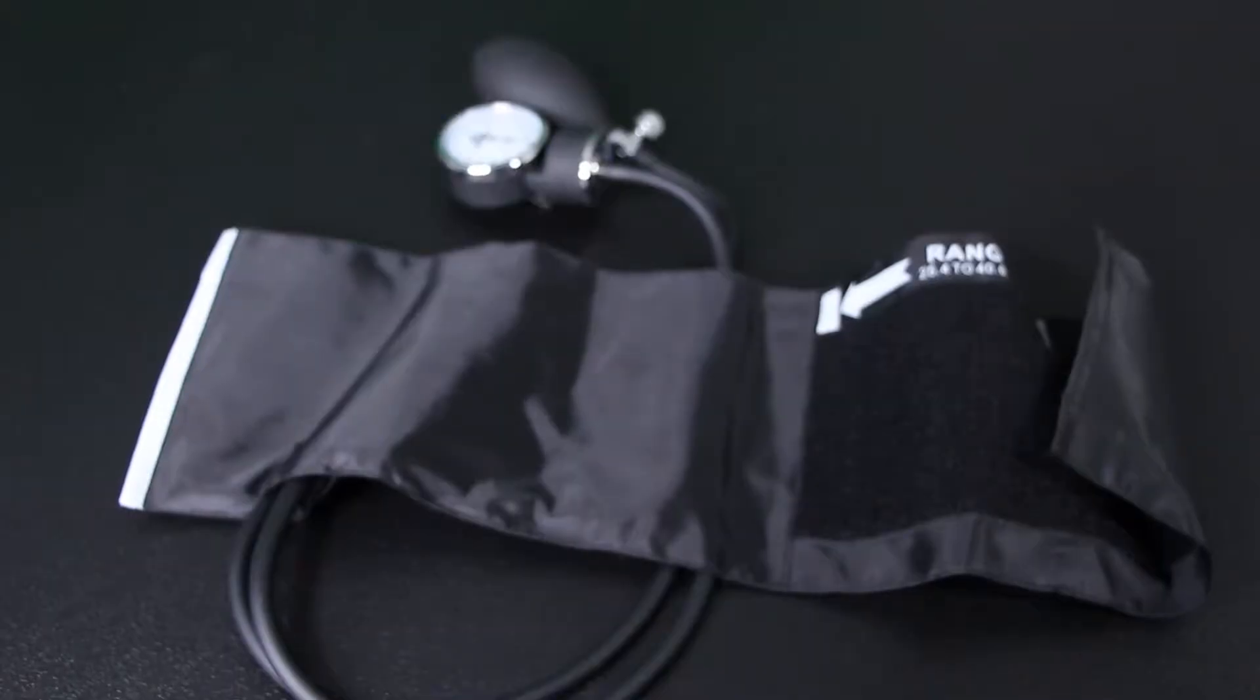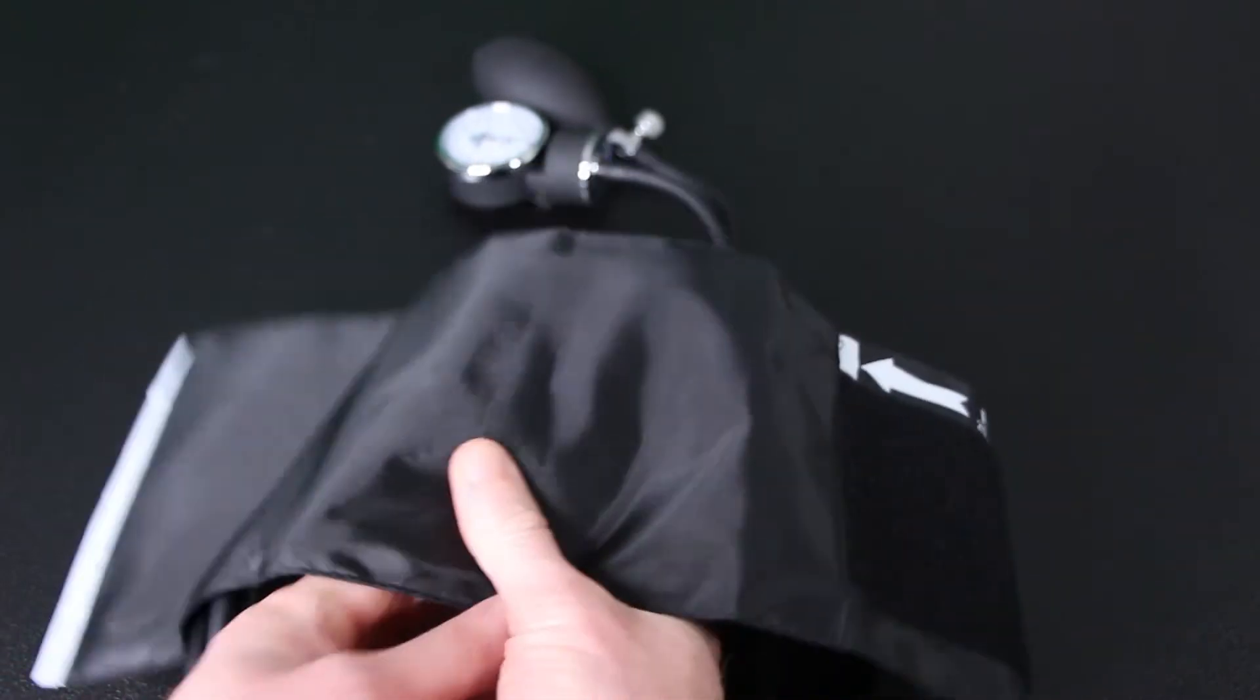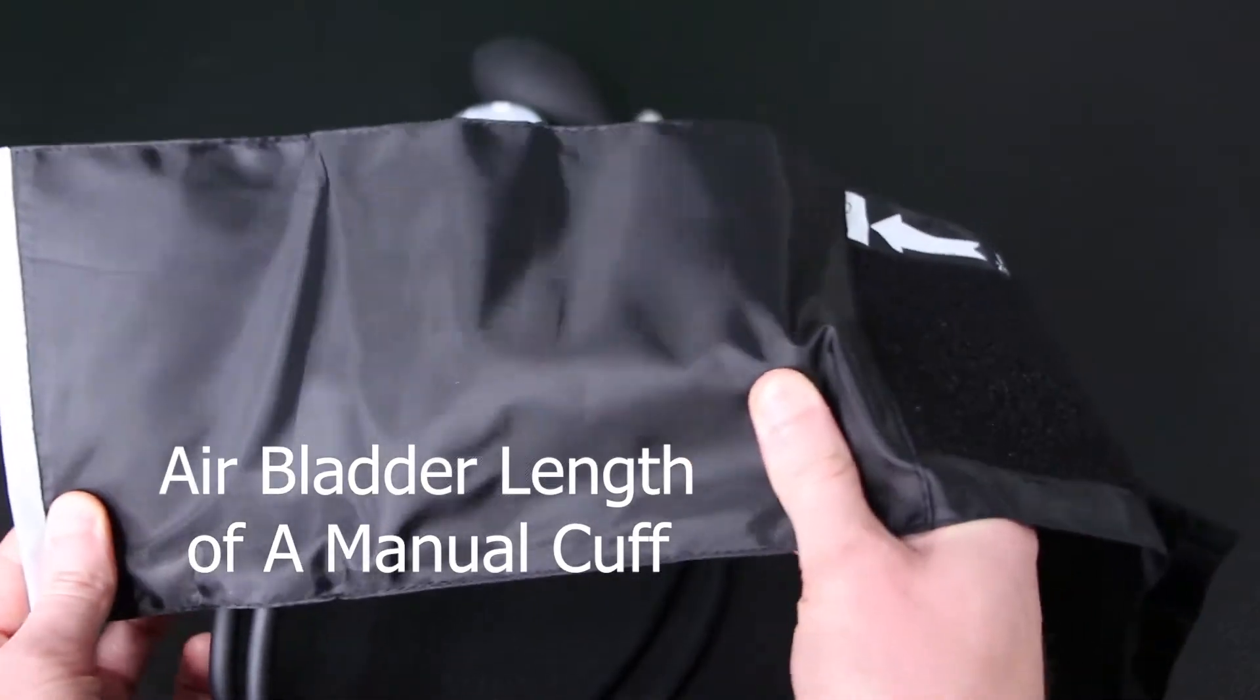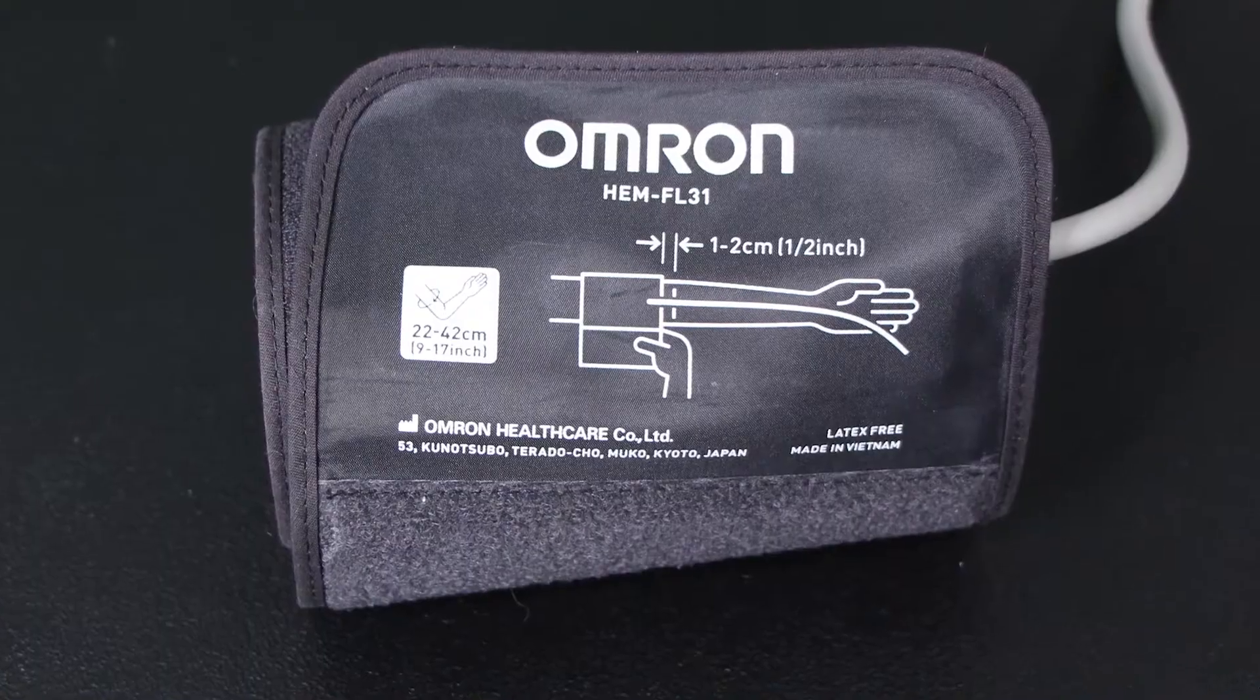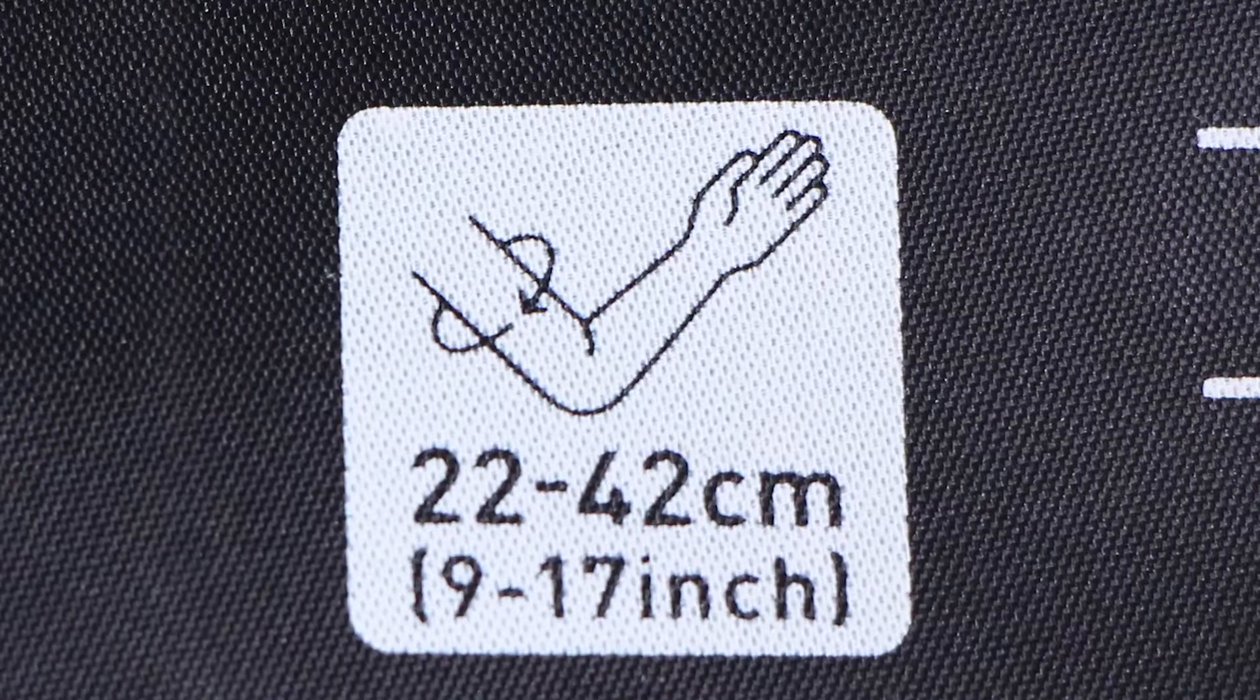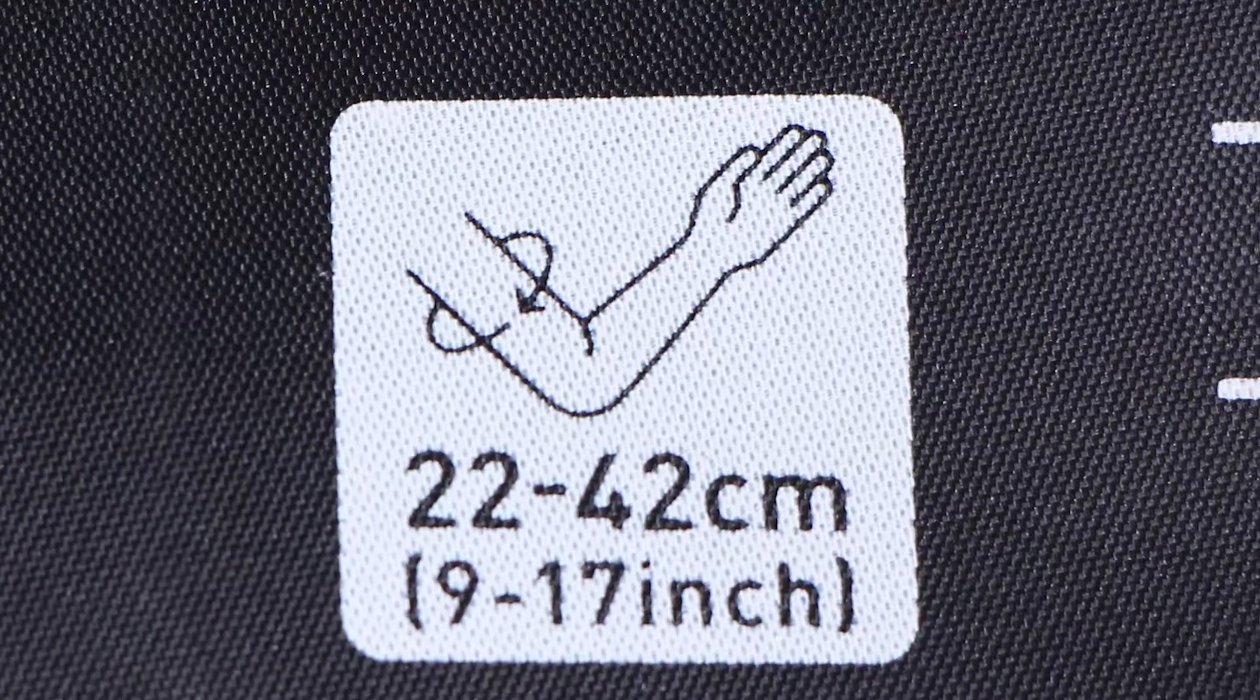It's important to make sure that you're using the proper size cuff. Typically what you're going to want to do is find a blood pressure cuff with an air bladder in it that's going to be able to go between 80% and 100% around your arm. Not more, not less. The Easy Wrap style cuff that I'll be showing in this video is meant for arms with a circumference between 22 and 42 centimeters or 9 to 17 inches.